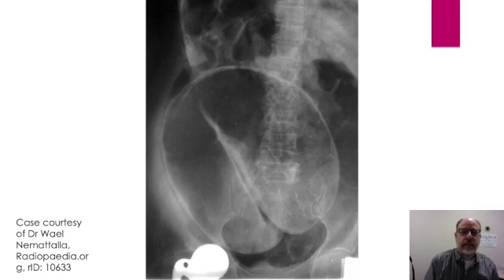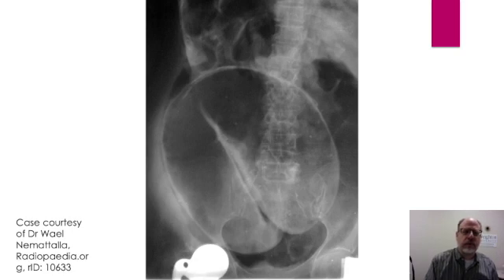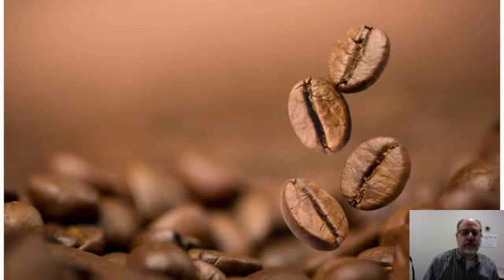Here is an AP abdominal radiograph of a patient in the emergency room with abdominal pain. As you can see centrally in the lower abdominal radiograph, there is a dilated loop of bowel arising from the pelvis — a typical location for sigmoid colon. This dilated loop of bowel has an inverted U shape, and there is a central opacity caused by the two opposed walls of the sigmoid colon. This is called the coffee bean sign, as some radiologists thought this looked like a coffee bean.